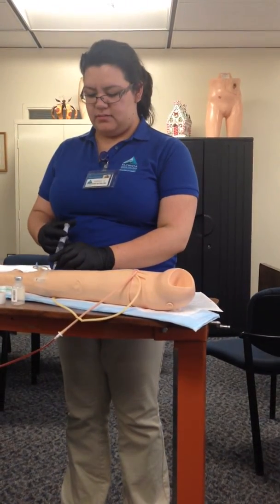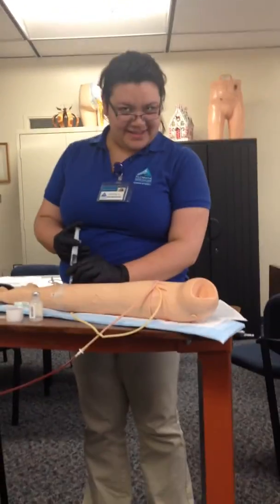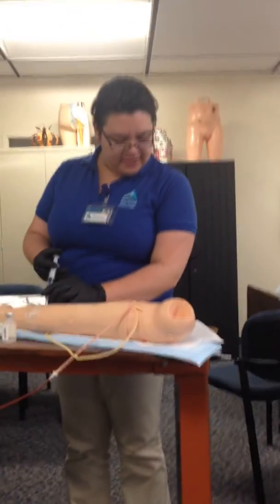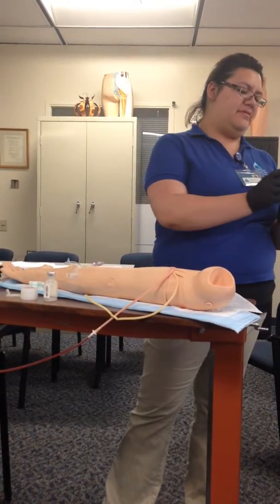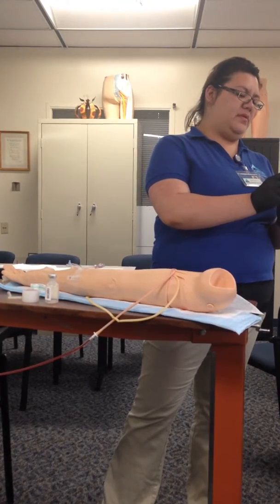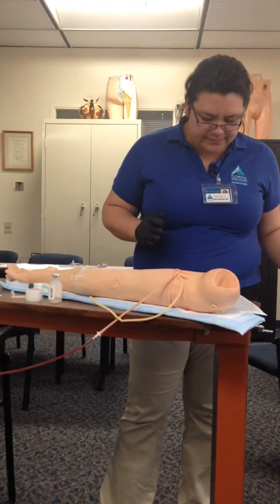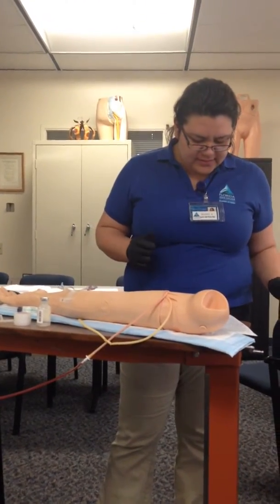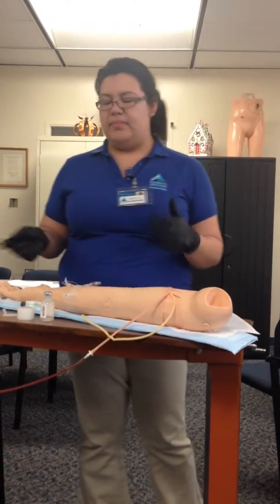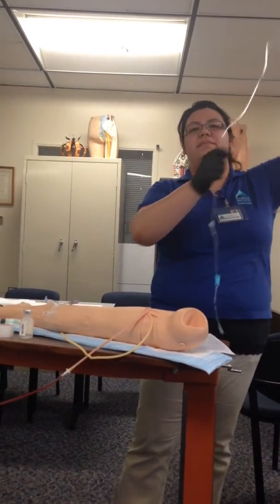Flush the line with 3 cc's, I'm sorry, 3 cc's. And then so now I'm going to apply the tubing.